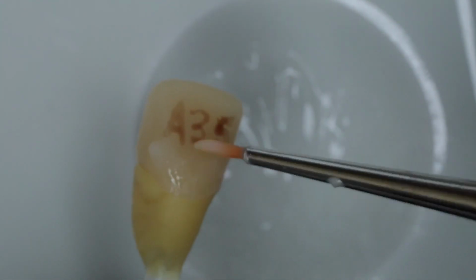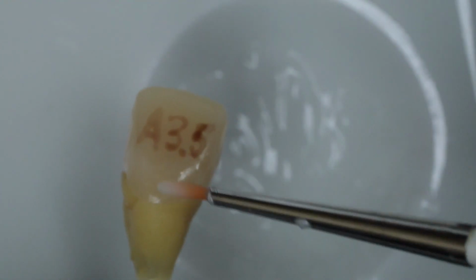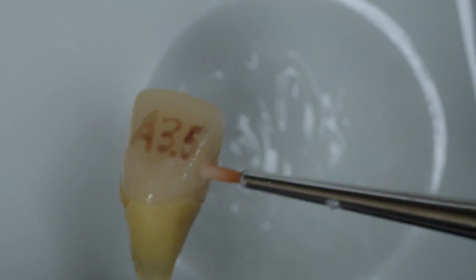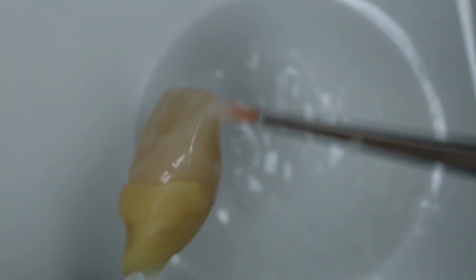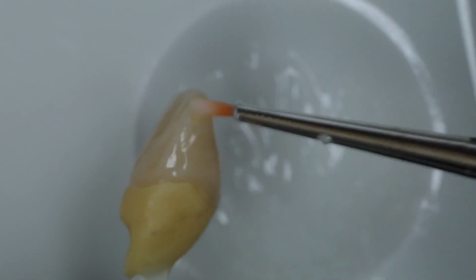So I'll kind of apply this all over, and then we'll kind of thin it out a little bit.